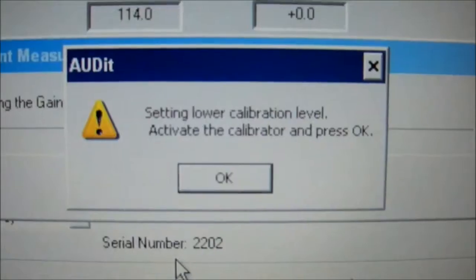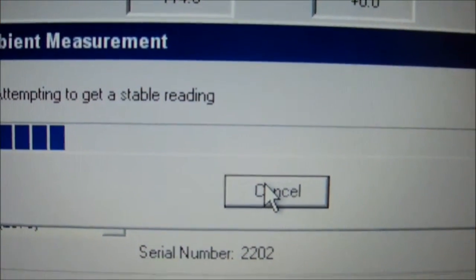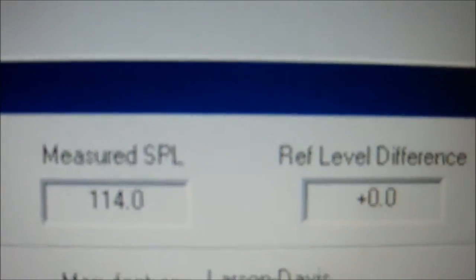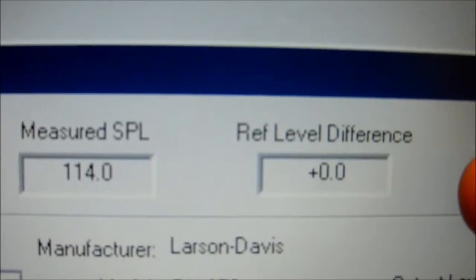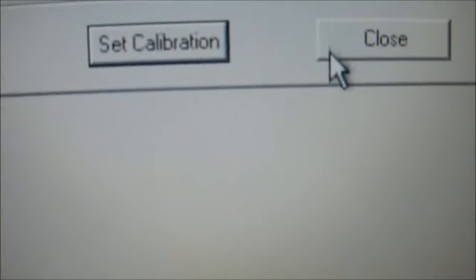Press activate the calibrator and press OK. So we are going to activate the calibrator. Press OK. It's getting a stable reading — it's stabilizing. And voila, you have a calibrated level and zero difference. And press close.